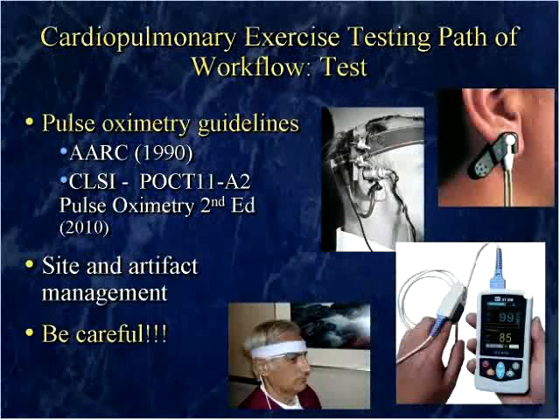Reflectance technology is another type of probe that you can use. This is a great adjunct to exercise testing and looking for exercise-induced desaturation, but be very careful with it and just make sure that you have the appropriate tools.